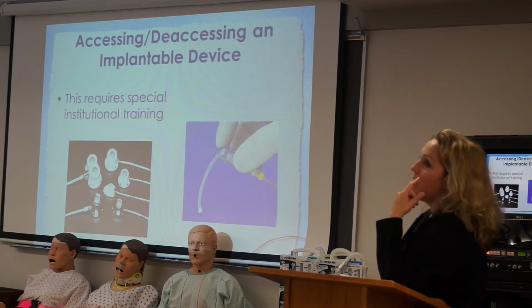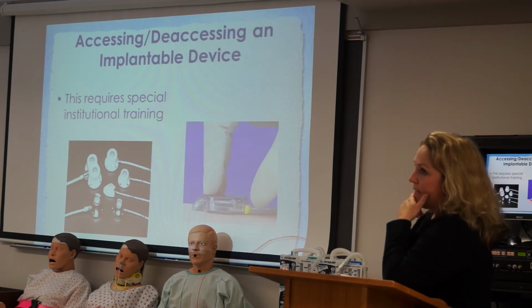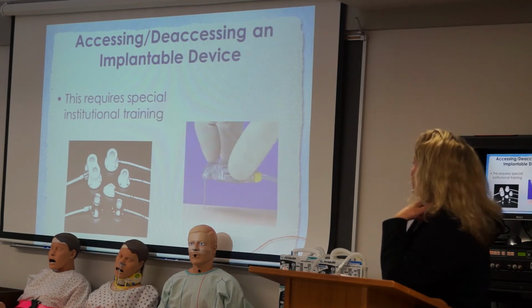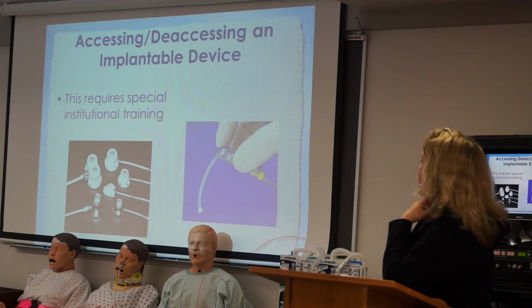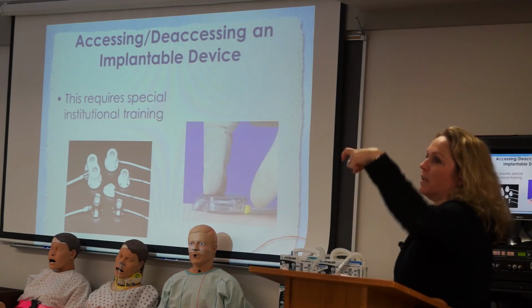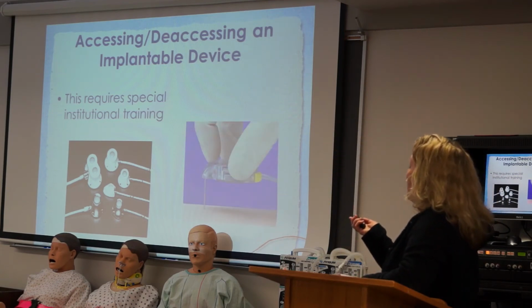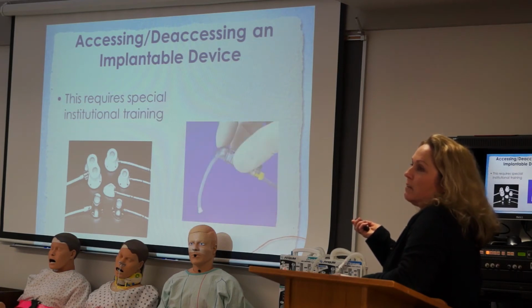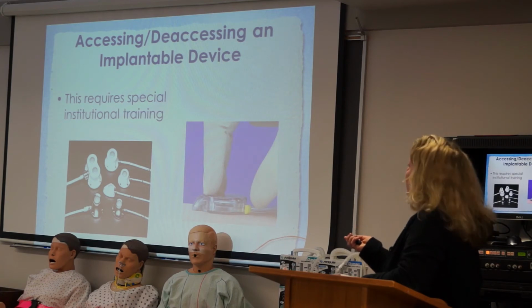Some facilities will numb the skin with some lidocaine. Where I worked, we never did. We weren't that nice. Most patients didn't complain of pain. You can choose the size of the gauge of these needles as well, but you'll just notice that's got a covering on it, and you take the covering off and you'll see that it is kind of a funky shaped needle. They can stay in for a long time as well, for a couple days. The needles can, but the ports can stay in again for years. So they're very nice to have.